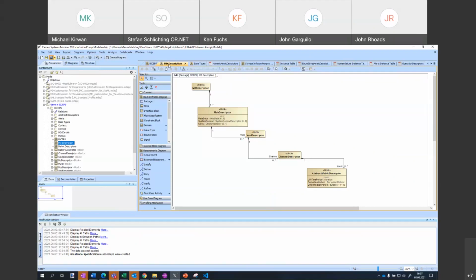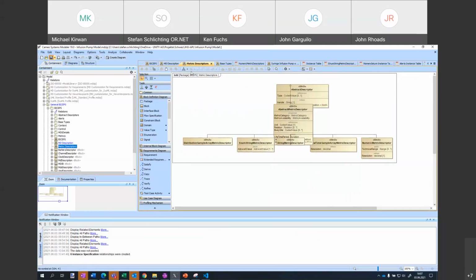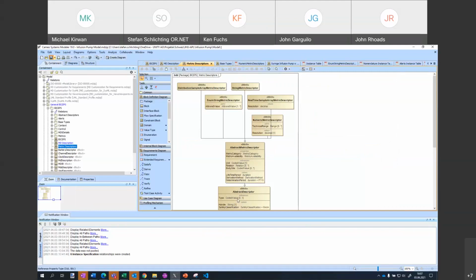Of course, what we did is we created a SysML model in Cameo for the constructs that are defined in BICEPS, and we use this meta model then to instantiate the infusion pump model. To give you a very short overview, we of course have an MDS descriptor. We do have a VMD descriptor, a channel descriptor, and in this case an abstract metric descriptor. But of course we also have all the special metric descriptors, like numeric metric descriptor and so forth.